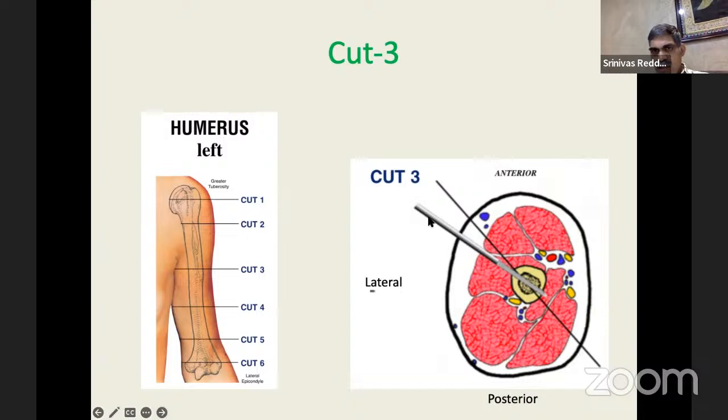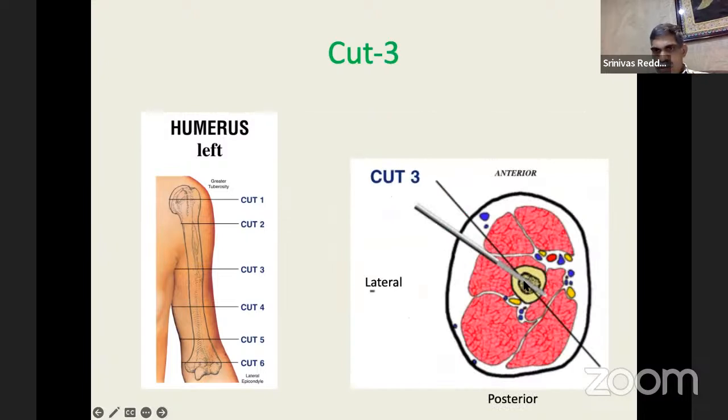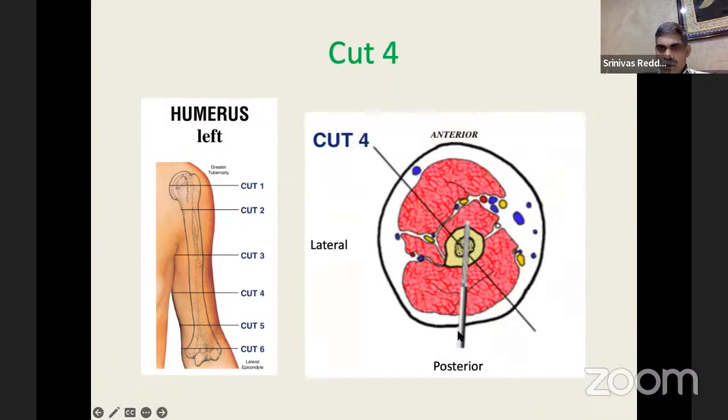From the lateral side, we are passing the Schanz pins, and the wire is also passed from within the safe zone, which is here. You see the radial nerve and the vessels here. This is the radial nerve, this is the ulnar nerve, this is the median nerve, and the brachial artery.